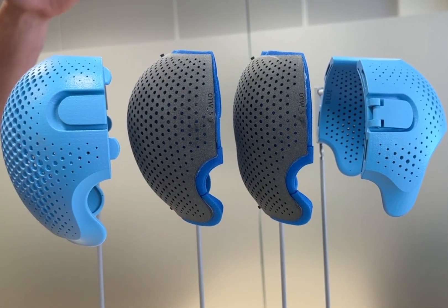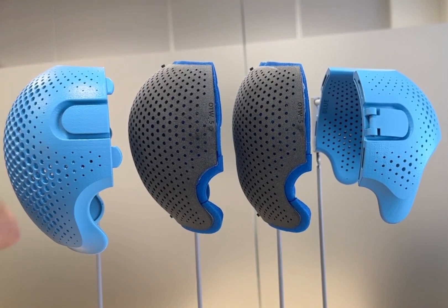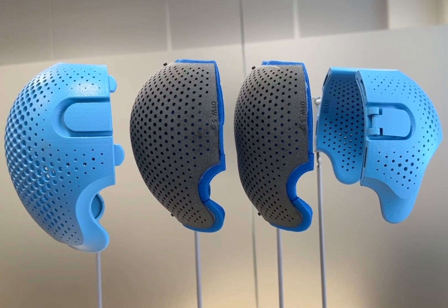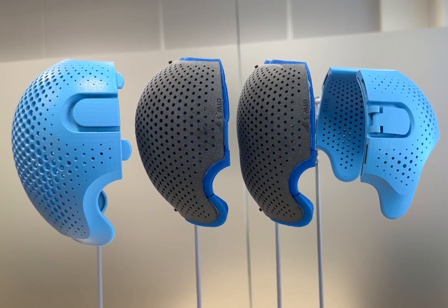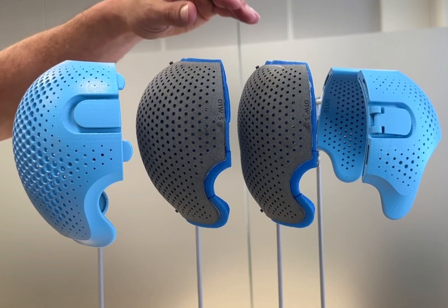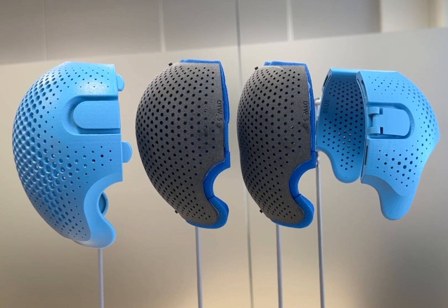The unique factor of the 2-in-1 design is that it actually comes to you with two different shells. The first shell will be installed when it comes to your office and is usually utilized for approximately the first four to six weeks of helmet wear. Once the patient goes through that first growth spurt and gains some more symmetry, the orthotist has the ability to then remove the first shell and install the second shell, which allows for additional growth throughout the treatment process.